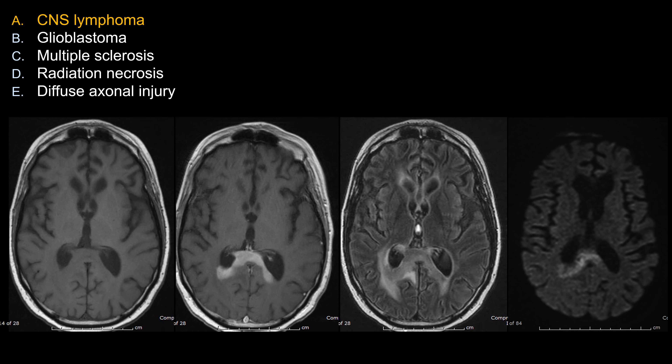The best answer here is choice A, CNS Lymphoma. Let's look at some of the key findings that make choice A the best answer in this case.